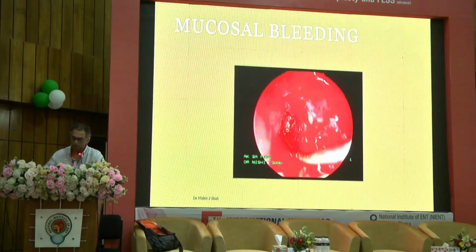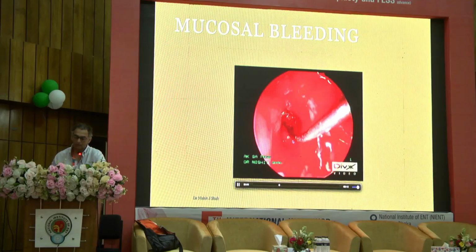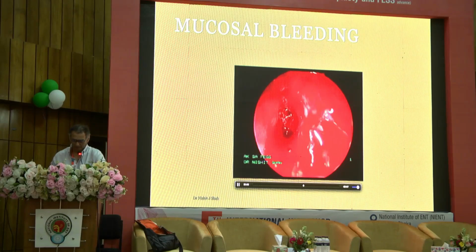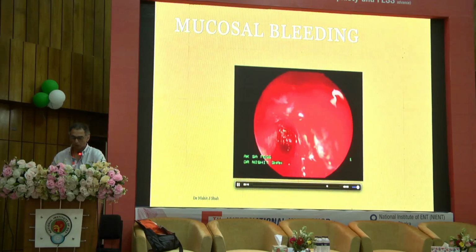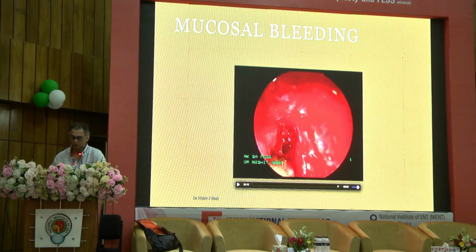So for example, this is working towards the frontal sinus, and you see there is a lot of bleeding in this area, and it is not a good idea to continue operating when you have so much blood here. What happens is that you will put in a suction there. A suction is going to cause circumferential trauma, and in this very narrow area of the frontal recess, you're going to get synechiae and closure. So you have to get some patties in, get some hemostasis, open up the ethmoid if you need, allow the blood to drain away. So how will you do all these things, right?